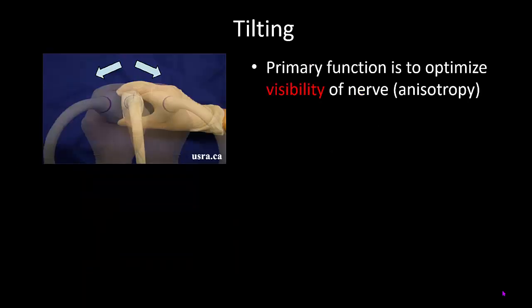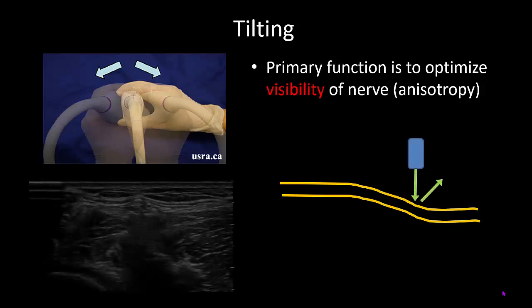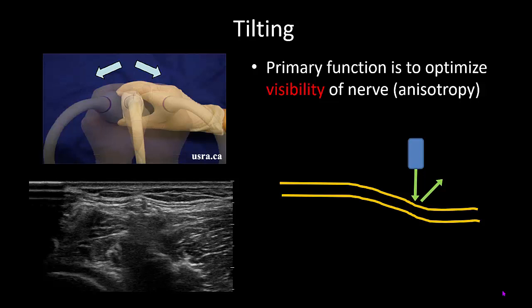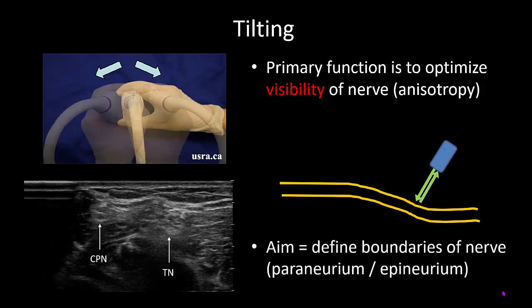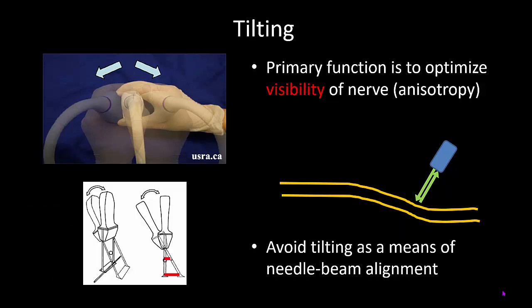The primary function of tilting is to optimize the visibility of target nerves. This is due to a phenomenon called anisotropy. Simply put, nerves do not run parallel to the skin surface, so when the ultrasound beam hits them, it may reflect away from the probe rather than towards it. The popliteal sciatic nerve is a good example of this — you can see here that the common peroneal and tibial nerves are barely visible. But by tilting the probe to orient the beam perpendicular to the nerve, we maximize the return of the echoes and thus the echogenicity of the nerves. The optimal tilt is the one where the boundaries of the nerve are best defined. Tilting should not, however, be used to try and align the beam with the needle during insertion, as it is very difficult to make small translations in beam position by tilting, and the translated distance also varies with the depth of the structures.